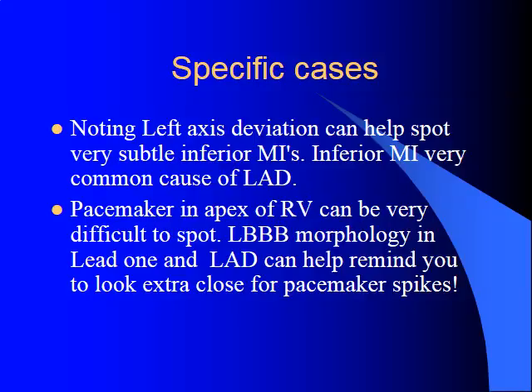Back in the old days, with pace rhythms, it was really easy to pick them out. They were very distinguishable because of the different amperage and electrical voltage that they used. With the newer ones, it's not so easy. They leave a very small trace sometimes, especially with these demand ventricular pacemakers, that it can be really difficult to spot them. So if you don't see that, it can lead you down a path that is incorrect.